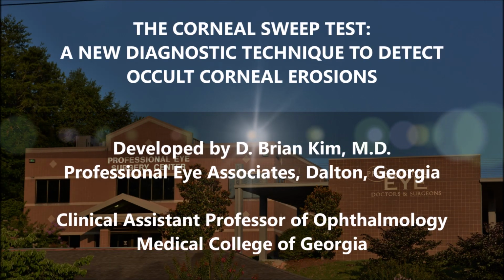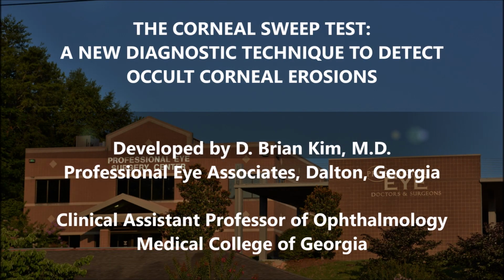I'm going to share with you a technique I developed on how to detect occult corneal erosions. Traditionally, the way we were trained to look for corneal erosions was based upon history of trauma and also based upon physical findings on the slit lamp examination, whether it was by staining or by visualizing areas of epithelial irregularity.